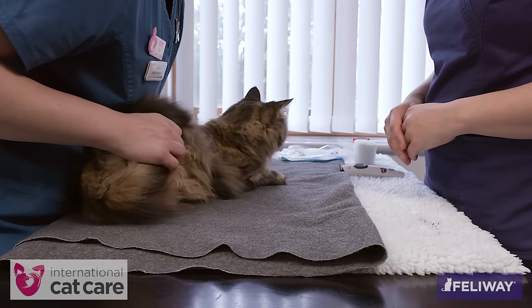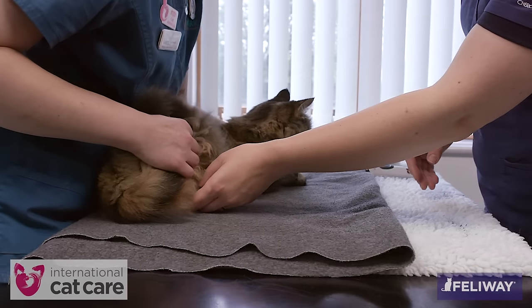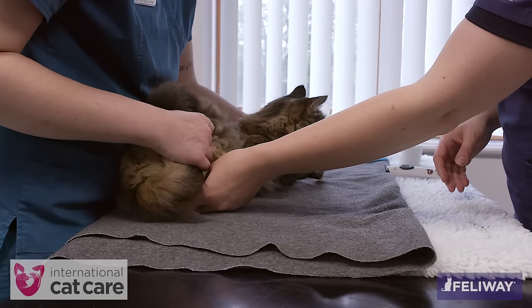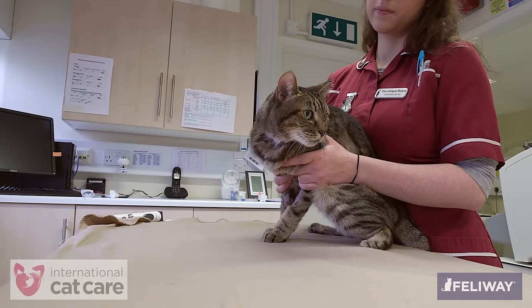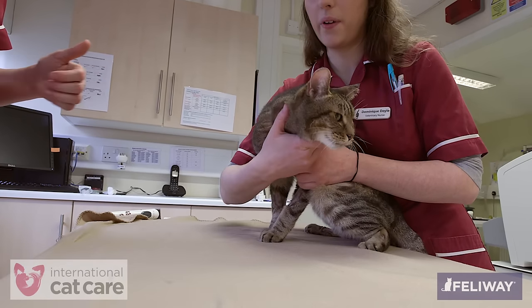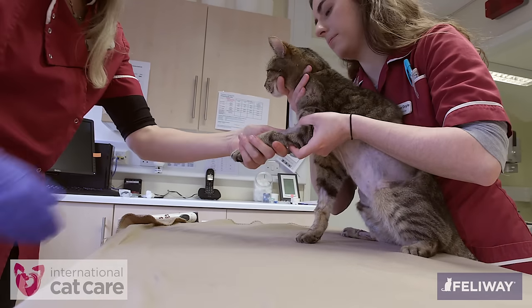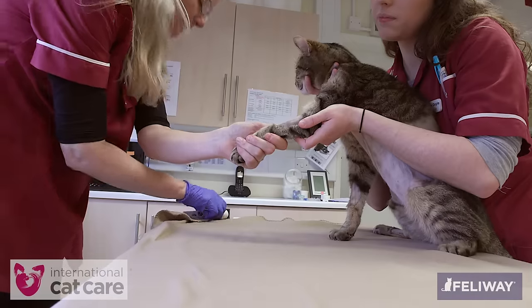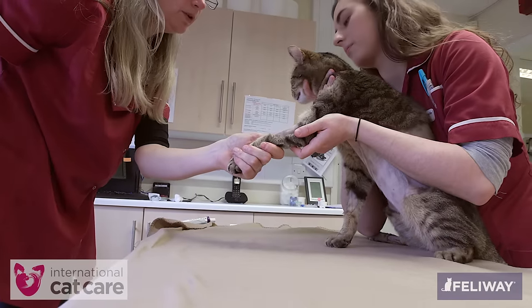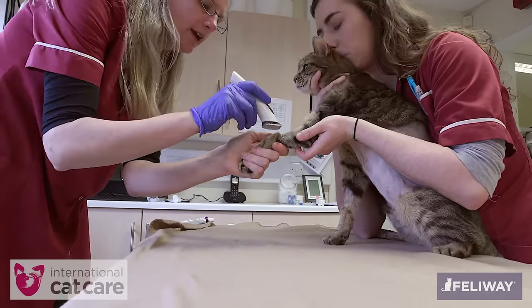A large soft towel on the table prevents the cat slipping. It's then readily available should it be required to wrap the cat to enhance its security and assist with restraint. The assistant is standing behind the cat and has lowered her body to provide security. She then gently restrains the cat's head with one hand while extending a forelimb at the elbow. Care should be taken not to overextend the elbow, as this can cause discomfort.